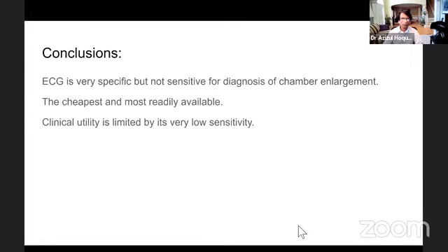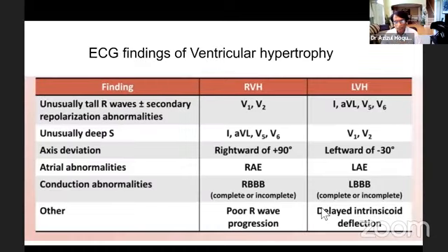All right, I can make some comments. Actually, very nice overview of ECG criteria for chamber enlargements. One thing I'd like, just for our students and trainees, to make sure they understand is the clinical connection of this chamber enlargement.